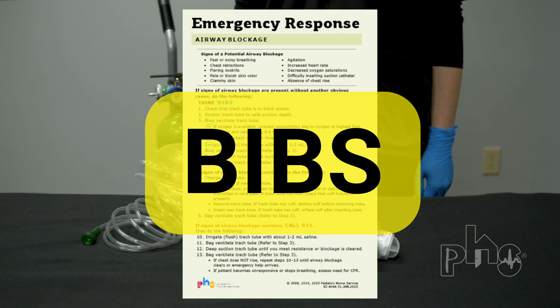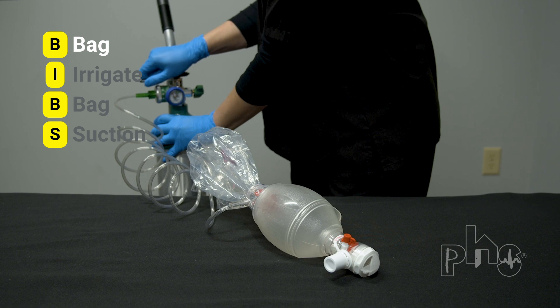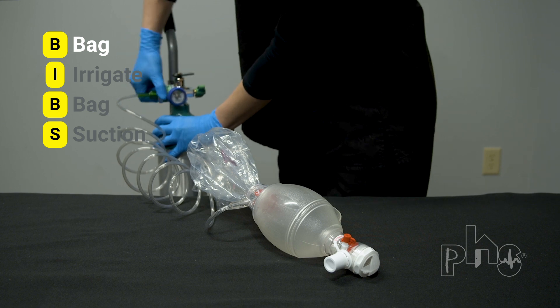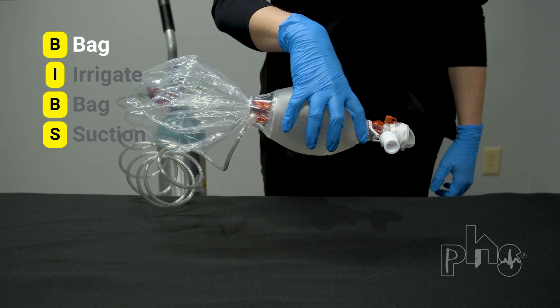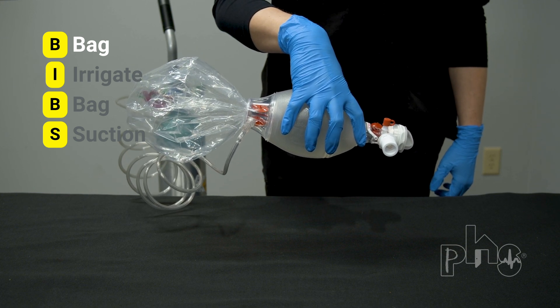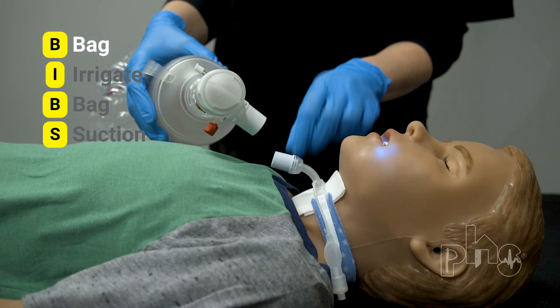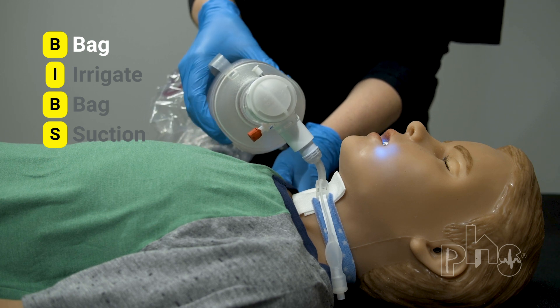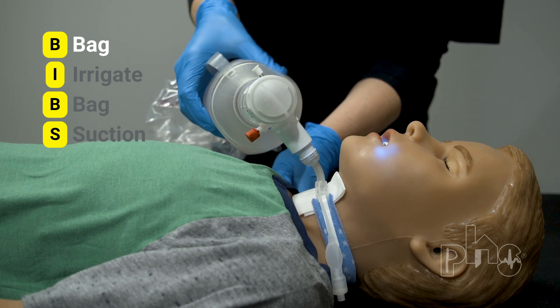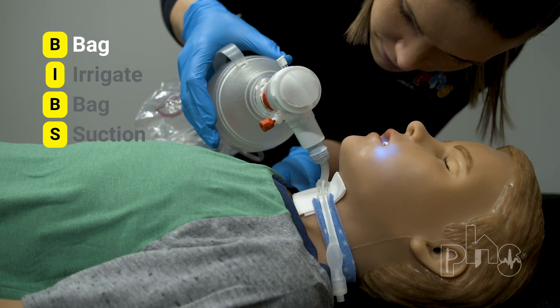If suctioning did not improve the patient's breathing, then perform BIBS. B is for bag, which means use the resuscitation bag. Attach the resuscitation bag tubing to an oxygen tank and turn the oxygen onto the highest flow setting. Listen for oxygen flow or check the bag reservoir to make sure it's filling with oxygen. Attach the resuscitation bag to the trach tube and squeeze the bag firmly about three to four times to give breaths. Look at the patient's chest to see if it rises each time you squeeze the bag.